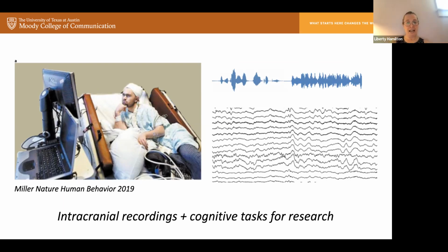There's also cognitive tasks. And so a lot of this is thinking about how to align that neural data to the events of interest. For some data sets, you may see that they include the actual stimulus that was played. For some, there may be annotations of the timing of, when is each trial? If it's a sentence, when does that sentence start and stop? Some groups have trigger pulses that they use to align the data. Some use a photodiode, which measures the luminance of the screen that has visual information.